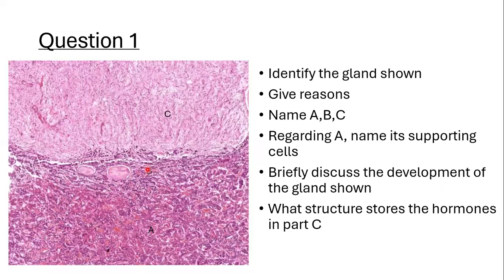So the pars intermedia produces which hormone? Which hormone is synthesized in the pars intermedia? Which hormone?